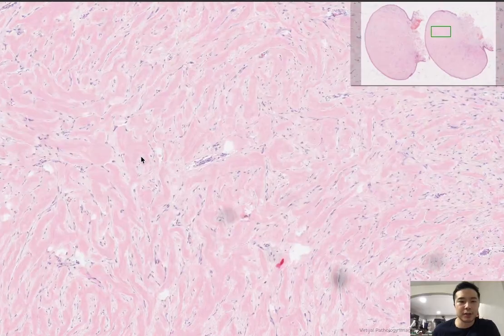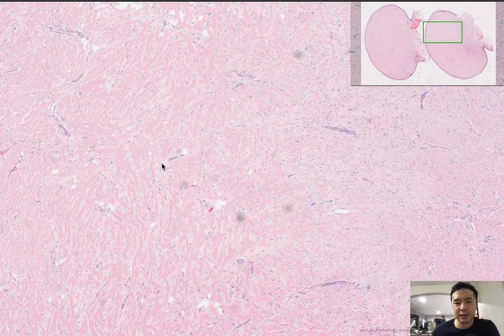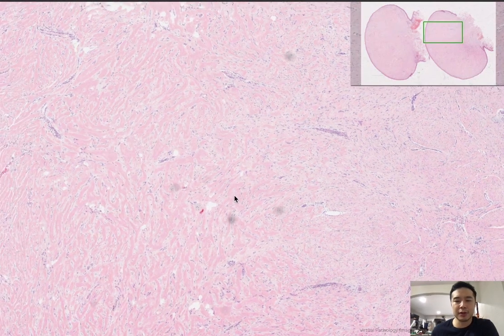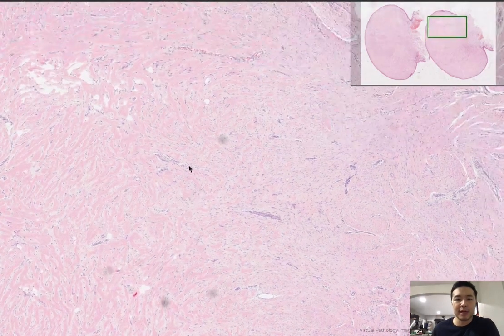Your differentials include morphea / systemic sclerosis. That will tend to have a more organized orientation of the collagen fibers, as well as the location as a hint. Usually keloids are on the earlobe, and it's caused after trauma.